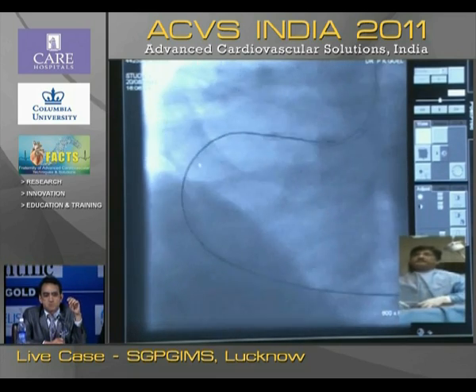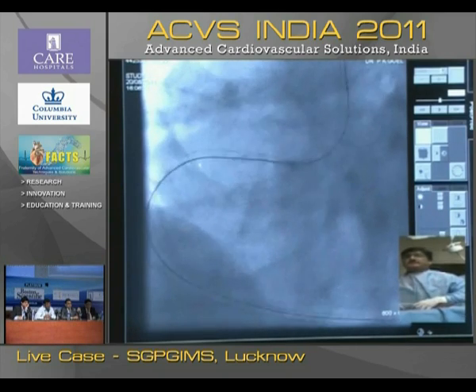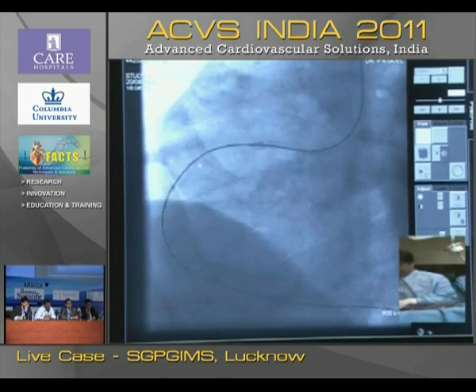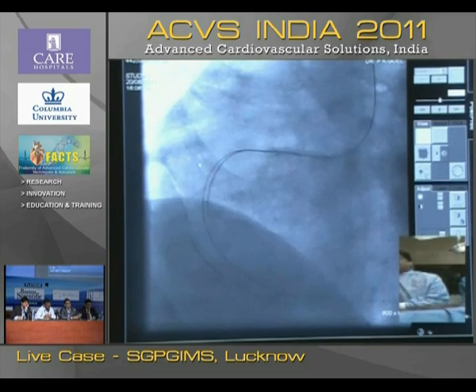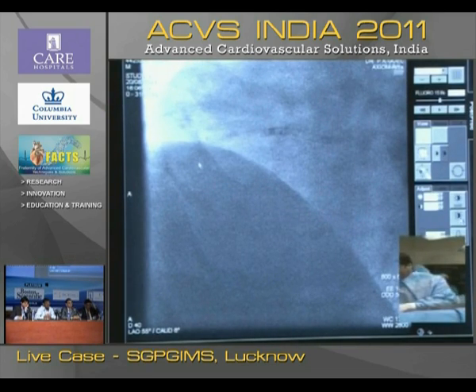You see here, it was probably better to use a microcatheter because there is some proximal disease, and the guiding is not that coaxial, so you endanger dissection proximally.